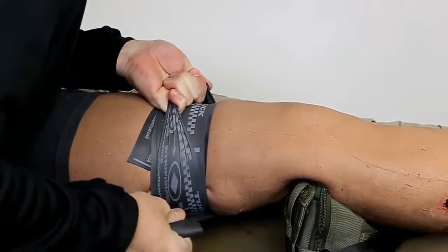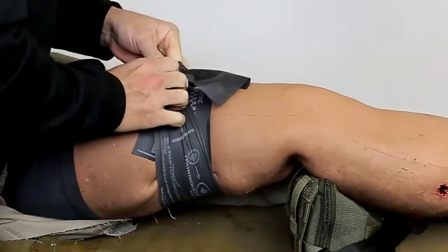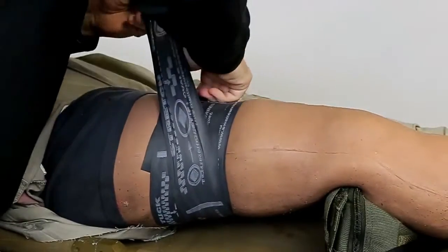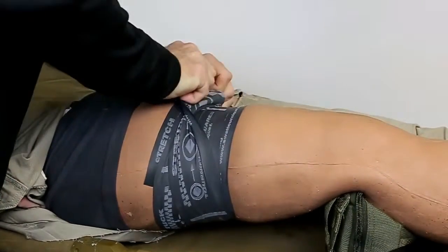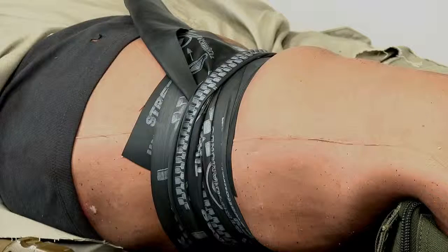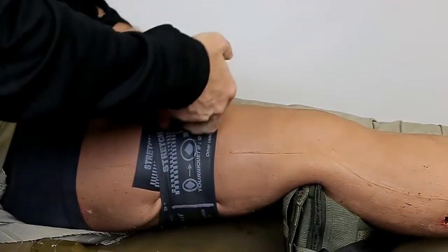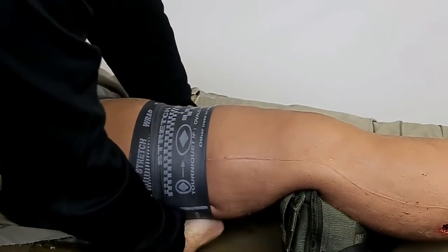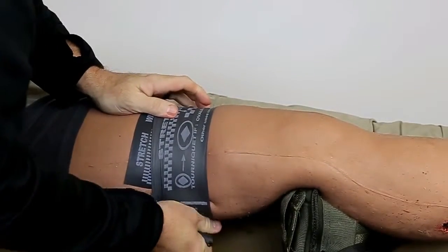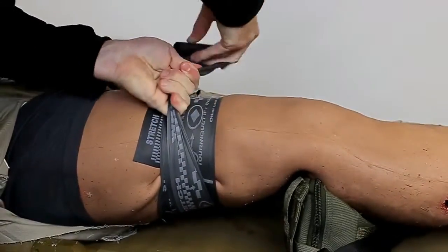If you forget to do this, do not unwrap the tourniquet. Simply locate the edge of a previous wrap and pull it up to make room to securely tuck the tail underneath. It is accepted that it will be difficult to wrap the tourniquet without some twisting or bunching in a real-world application. Nevertheless, every effort should be made to apply the SWAT-T as flat as possible, since less pressure is required to stop blood flow with a wider tourniquet. A wider tourniquet is also safer and more comfortable for the patient.